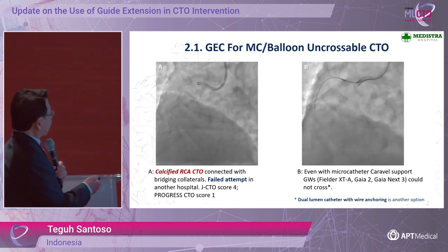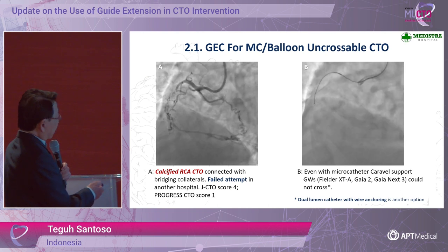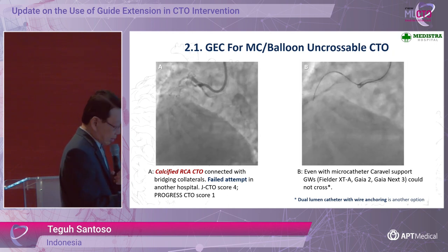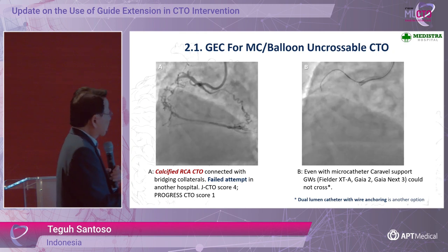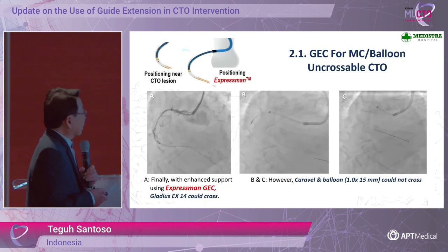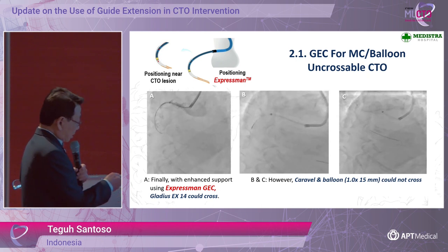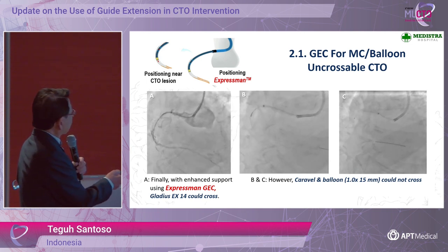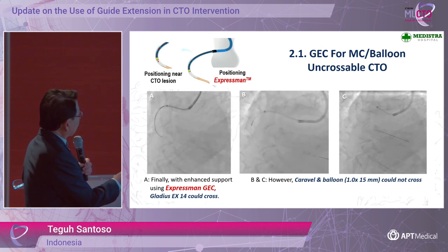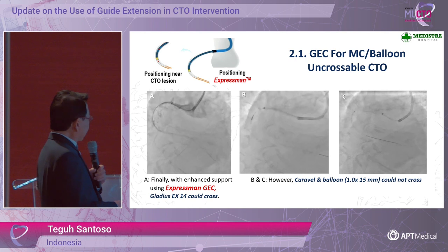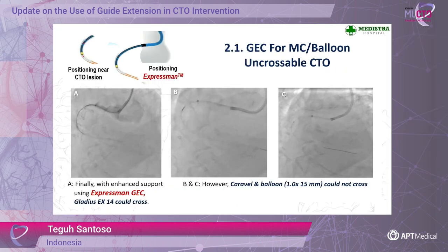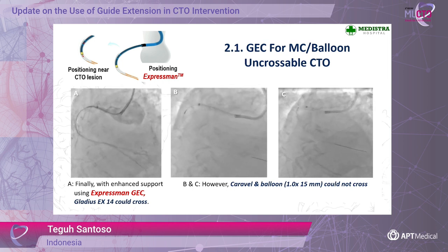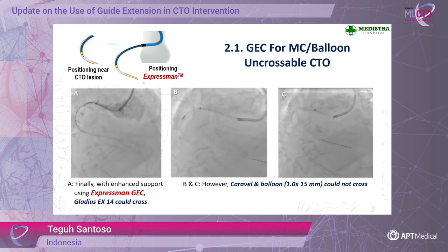There is a small side branch, so another option would be to use a dual-lumen catheter with wire anchoring. But in this case I tried to use Expressman, positioning the guide extension catheter close to the CTO body. Finally, with this enhanced support, Gladius X14 could cross — a wire I find very useful for antegrade approach, especially in long CTOs.